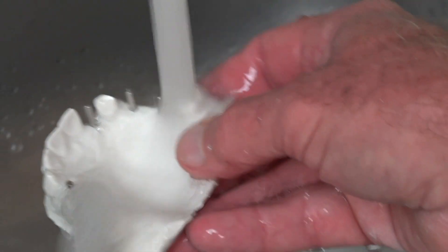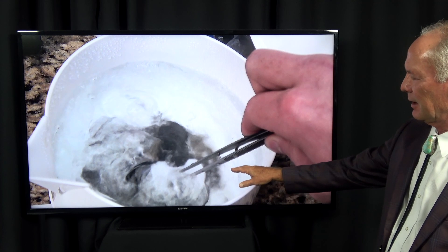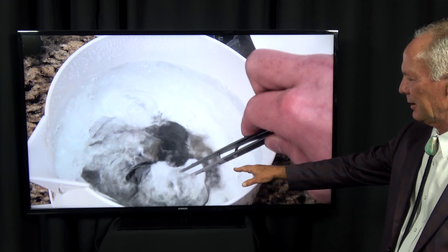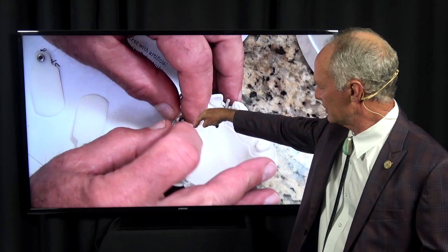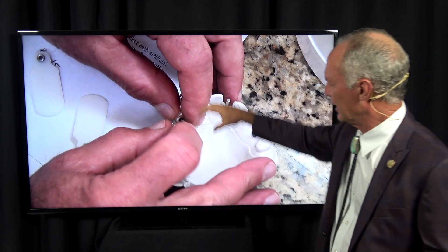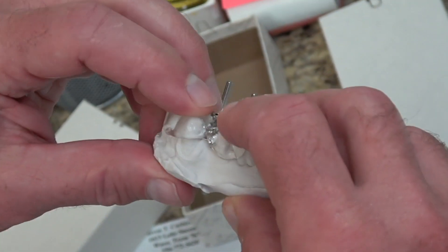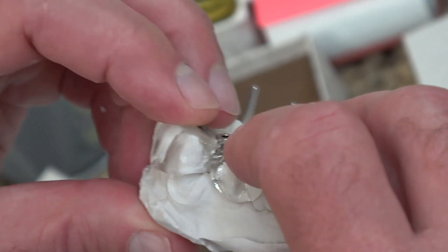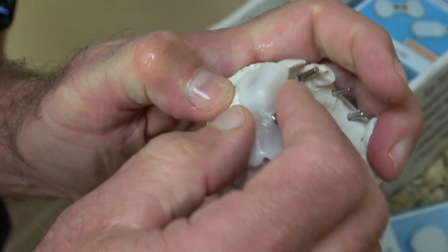First, wet the model thoroughly. Then put the Easy Stent in a tub of boiling water and leave it until it becomes clear — it goes from white to clear. Hold it with cotton forceps in the silver part until it becomes clear, which doesn't take very long. Then place the cylinder on the post on the wet model and conform it to the teeth on either side. You don't have to work too quickly — you've got some time. Make sure the cylindrical part is on the tissue.